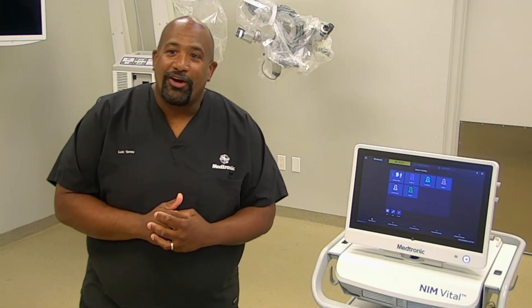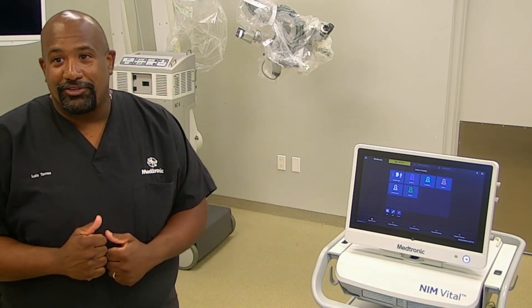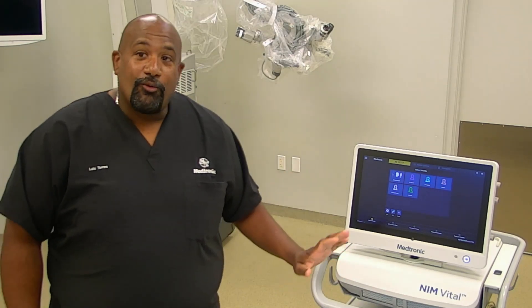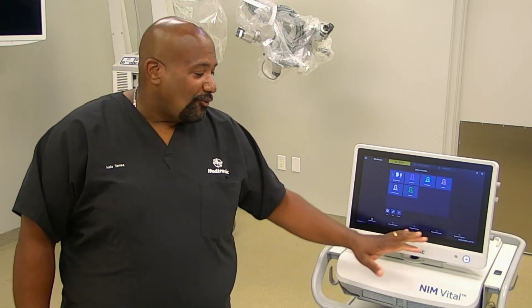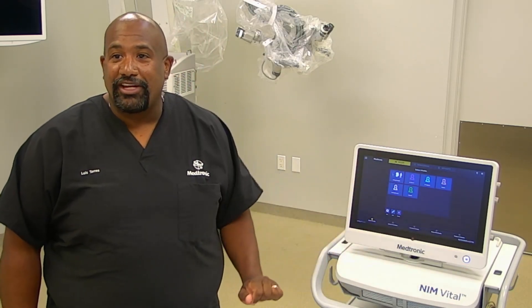This is a NIM vital quick start video for a parotid procedure. You're going to want to turn on your NIM — it's the button located here on the bottom right. Once the NIM is turned on, it'll come up to this screen here.